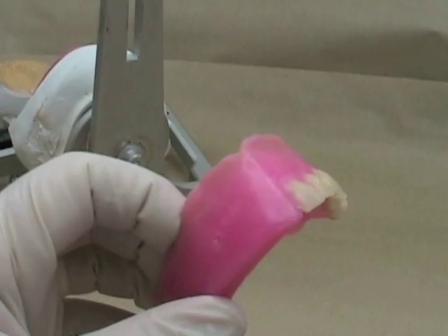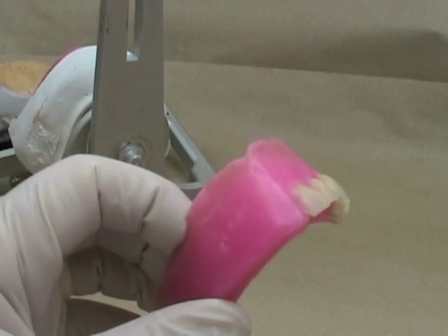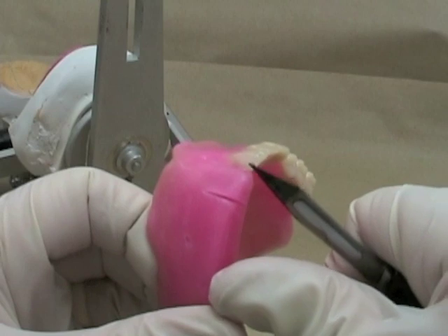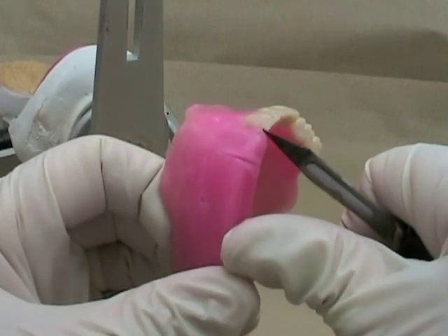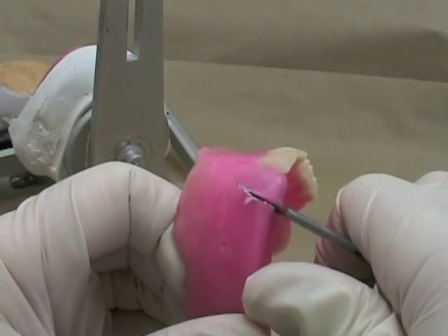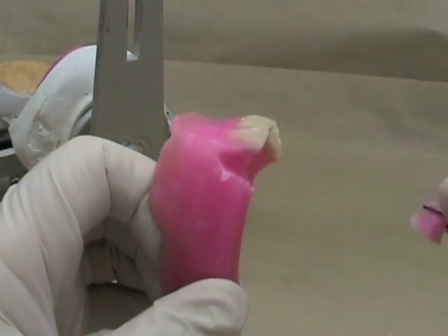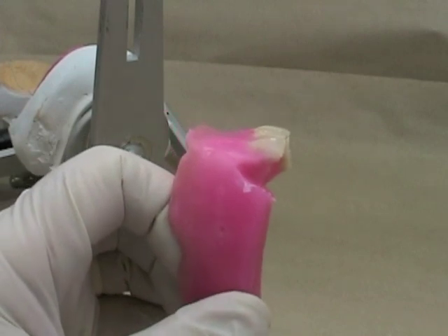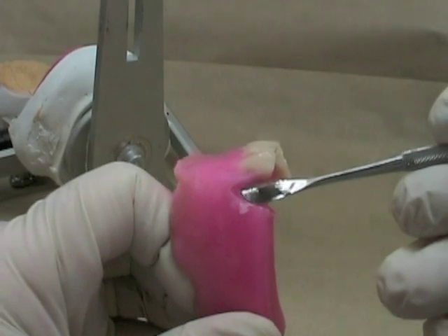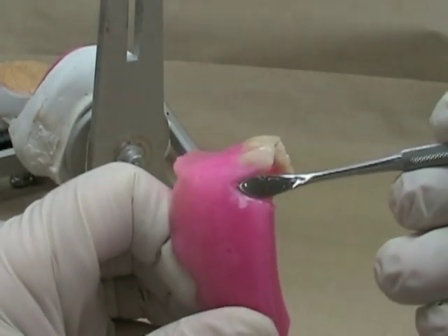If your maxillary rim is contoured properly it should show you on the facial surface where you want the facial surface of the corresponding tooth to be. When I'm taking out the wax you can notice I'm using a good finger rest so I don't slip and cut myself. Every year we have a few incidents where people don't use a finger rest when they're using a knife or a sharp instrument and they cut themselves — you don't want to be doing that.